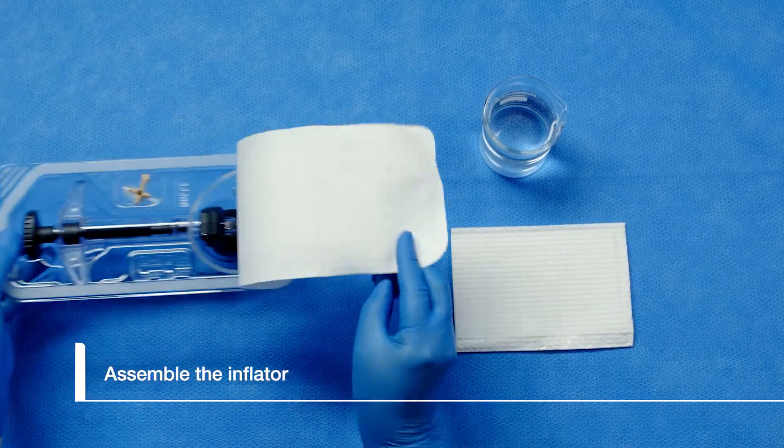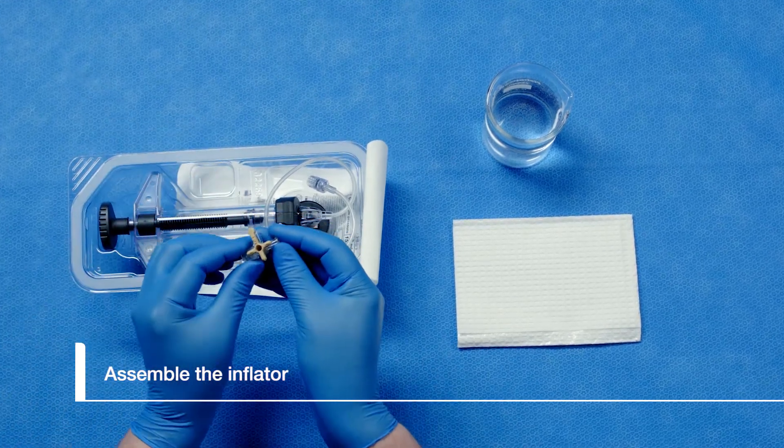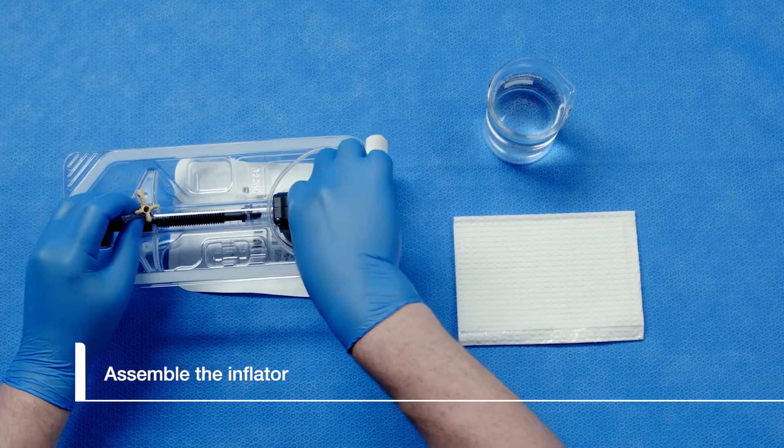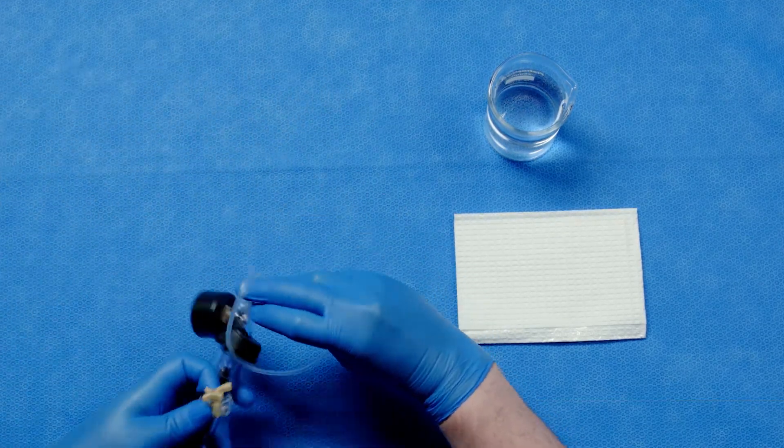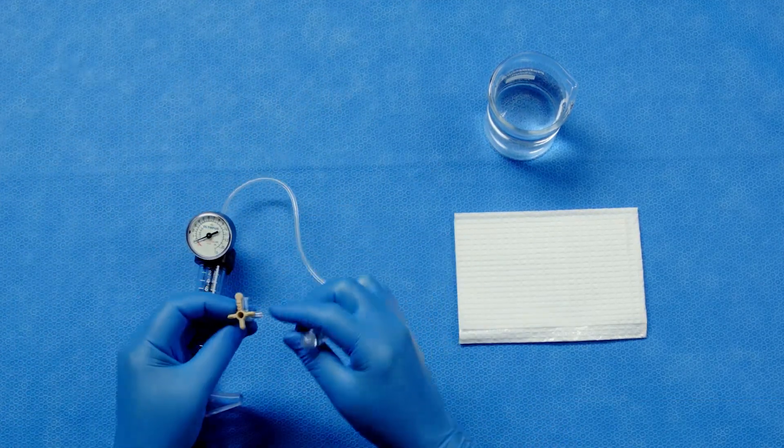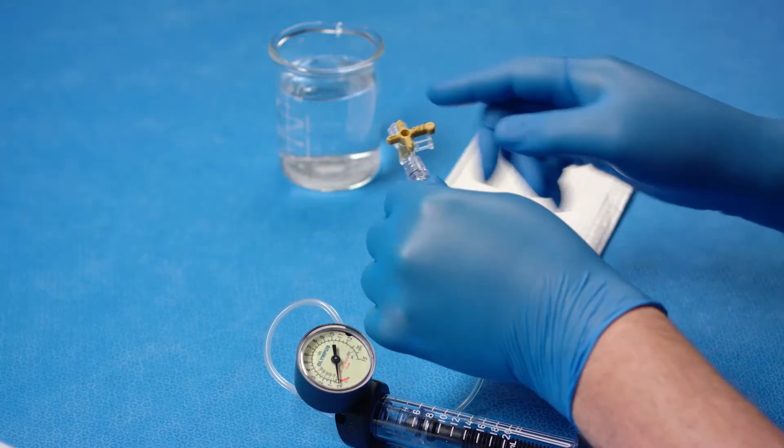To start, we will assemble the T-piece to the inflator handle. Remove the T-piece from the package and thread it onto the end of the inflator catheter. Ensure the locking switch on the inflator is in the left position so we may be able to fill the inflator.